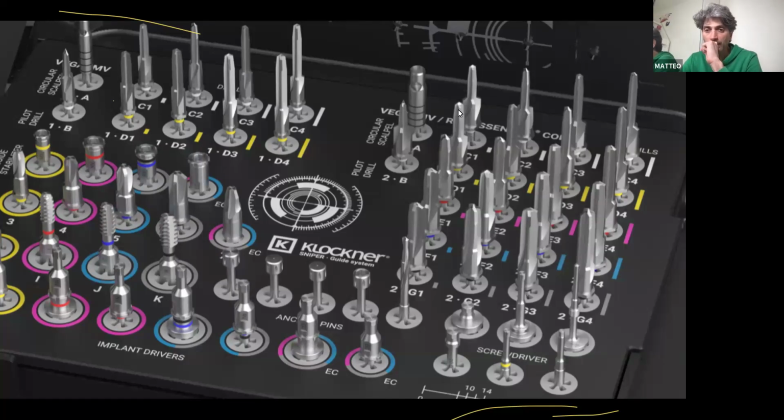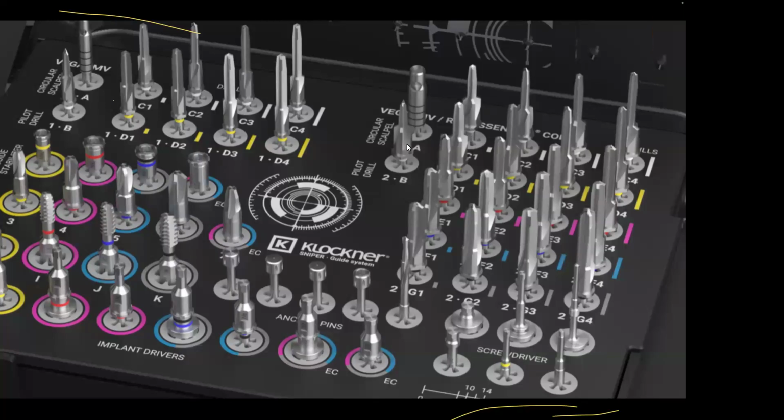The most important thing is that this is the first drill for 3.5, 4, and 4.5 implants.